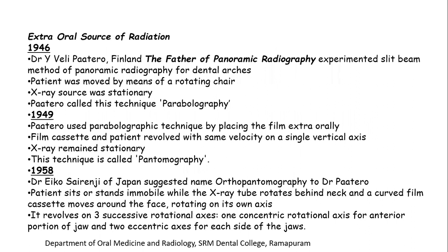The extraoral source of radiation was first discovered in 1946 by Dr. Paatero. He was regarded as the father of panoramic radiography, and he experimented with the slit beam method of panoramic radiography for dental arches. The X-ray source was stationary, and initially this technique was called parabolography. In 1949, it was renamed as pantomography by Paatero, using this technique by placing the film extraorally. A film cassette and the patient revolved with the same velocity on a single vertical axis. However, the X-ray source still remained stationary.